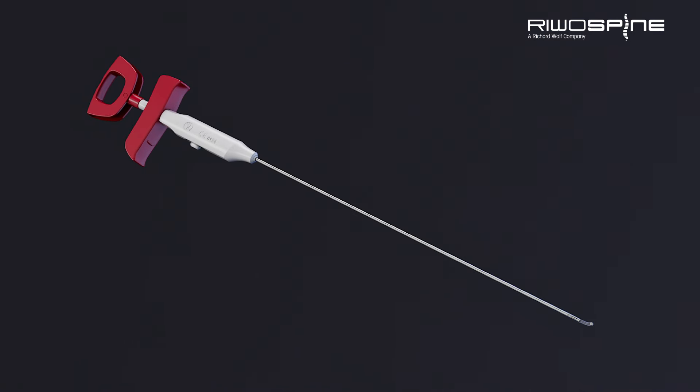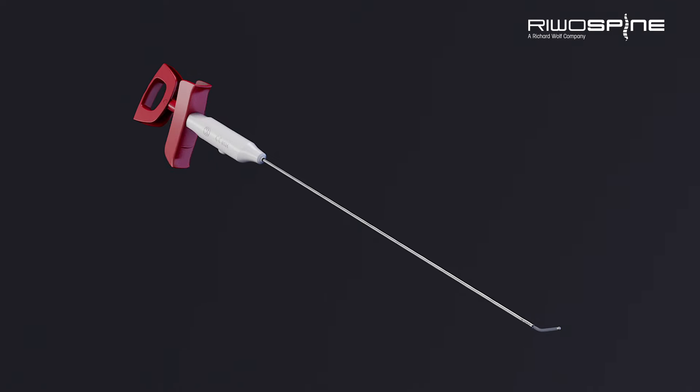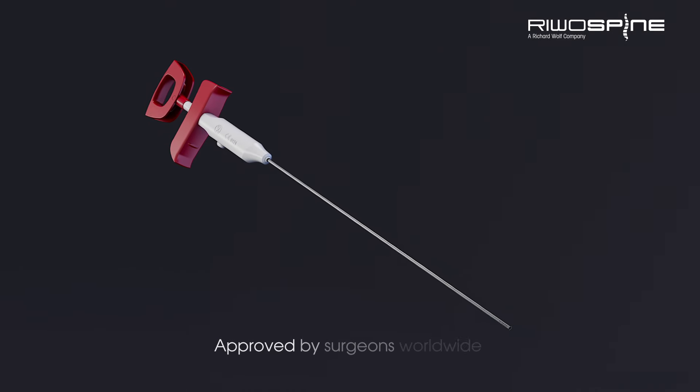Proven in thousands of surgeries worldwide every year, Riwo Spine tip control electrodes are your advantage in function and ergonomics.